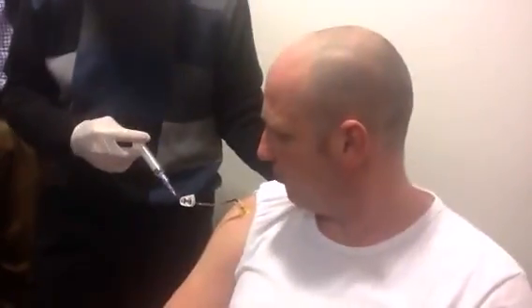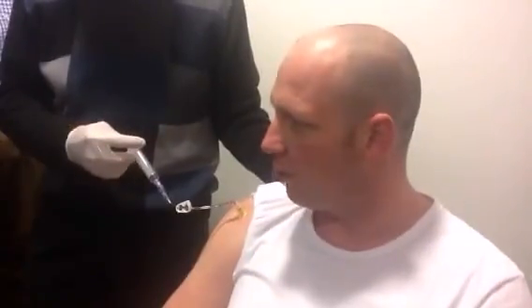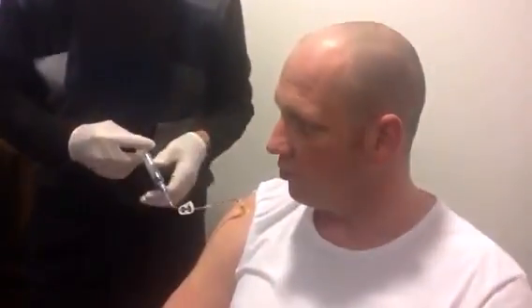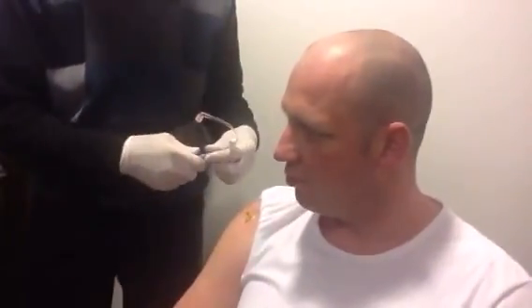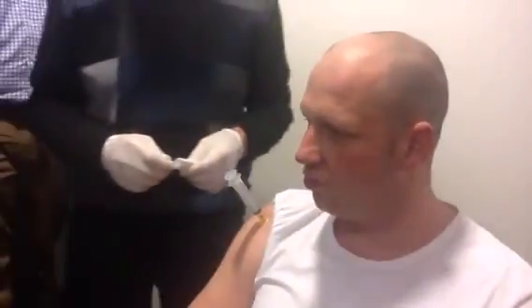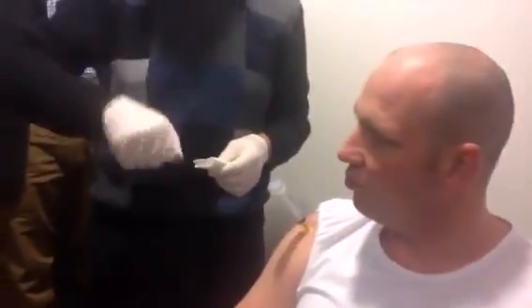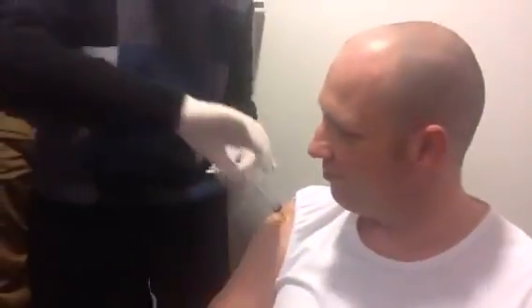There's the back end — does that hurt? Something more, but not bad. Not more than a three. Okay. So I'm going to take out the easy connect. I should have showed you how the stabilizer goes on there. I saw that. You already saw the stabilizer, okay. Sometimes it takes two or three pulls, but if you pull four or five times it starts hurting more. So pull it out faster. Be careful you don't jam it back in — be careful where you're going with it. I'm going to pull and twist.